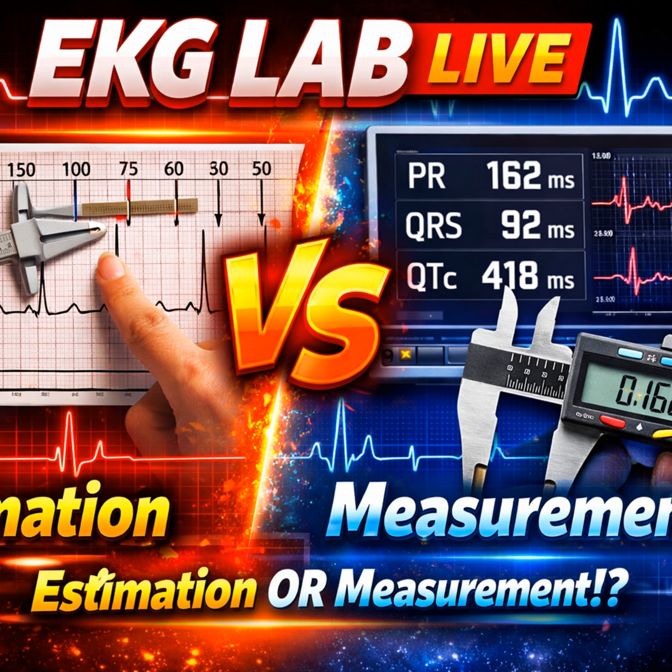In a code blue, the nurse's role, as defined by the crash scenario source, is specific. Start CPR, apply pads, analyze rhythm for shock, and administer epinephrine or amiodarone. Those are the correct steps, yes. There is simply no time to calculate exact axis deviation when the patient is in VFib. The nurse needs to look at the monitor, recognize the chaotic waveforms of VFib, and shout, "Shockable." That is pattern recognition saving a life.